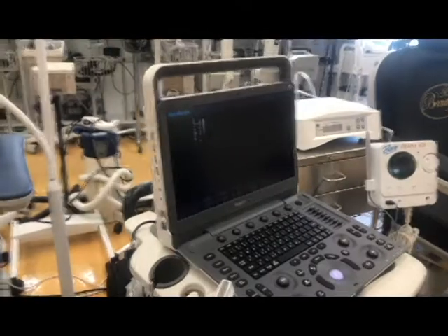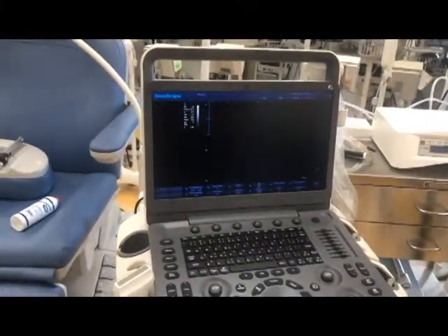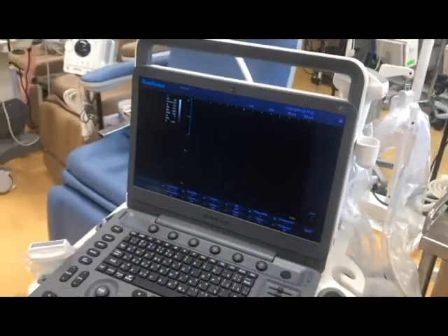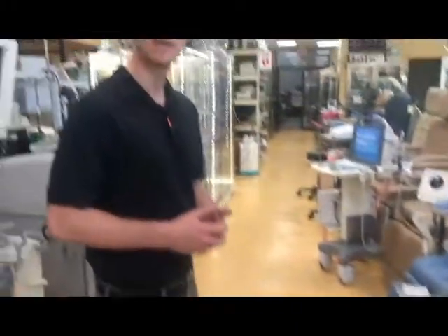By far it's one of the best ultrasounds in black and white OBGYN, and it's literally the best ultrasound on the market for the price. Doctor's Toy Store has it here — give us a call at 877-DRS-TOYS to buy your ultrasound today.